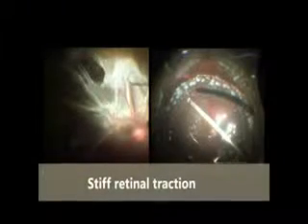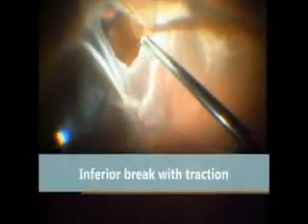This release of traction allows the retina to flatten. Endolaser barrage is carried out. However, in some cases, the retina fails to flatten despite removing the membranes.